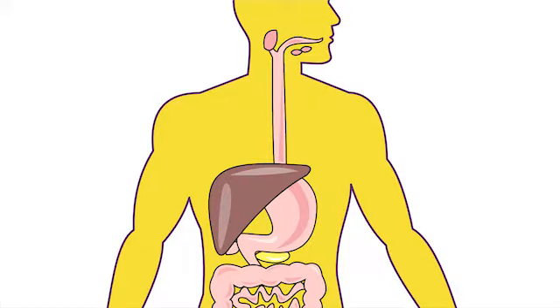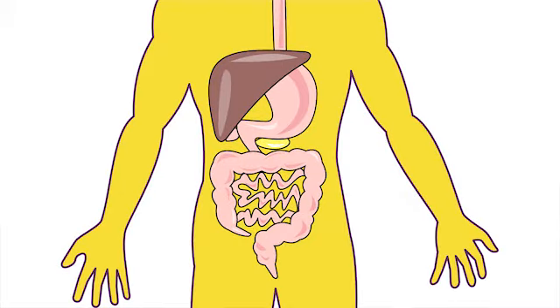Because the GI tract is basically a tube, it is easily studied with endoscopy. Upper endoscopy starts at the mouth and passes into the esophagus, stomach, and duodenum. Lower endoscopy, or colonoscopy, starts at the rectum and passes through the colon.